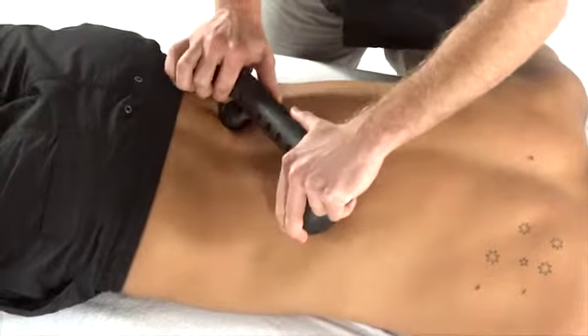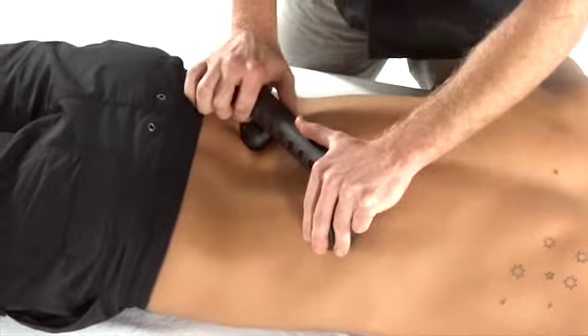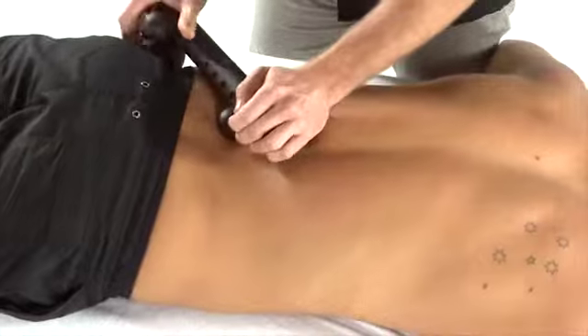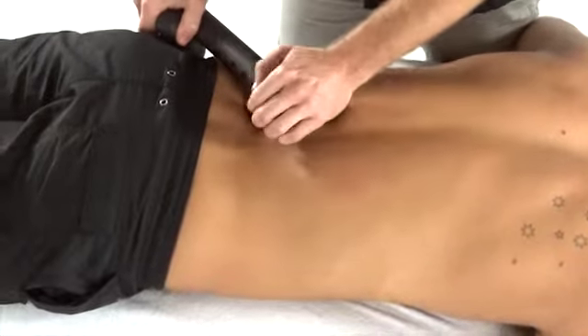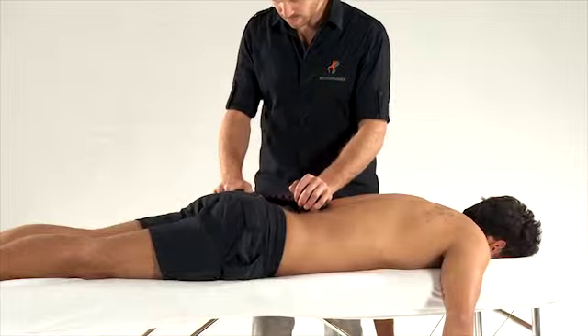Once again, placing the pivot on the opposite side of the body, or by turning the system around, stabilising it against the glutes and working into that region.